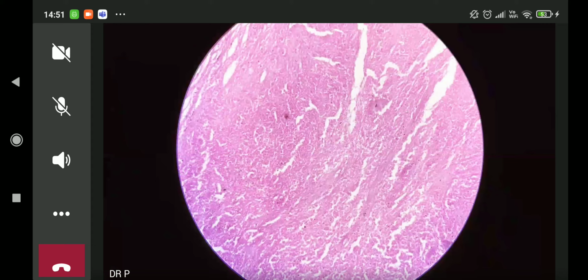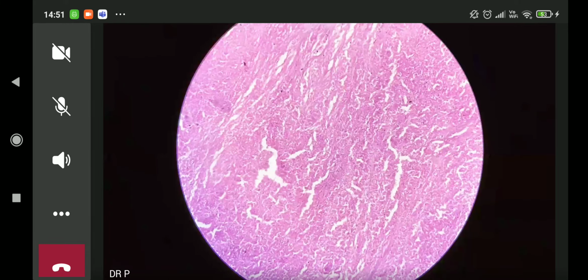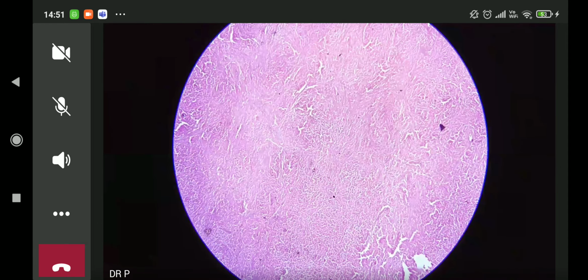Now, is there any other thing that can help us make the diagnosis of tuberculosis? So over here, as I've just shown you, this is extensive caseous necrosis. So this entire area, which should have actually been filled up with lymphoid cells and the lymphoid sinuses and all that, has been replaced by extensive, irregular, uneven looking necrosis, right?